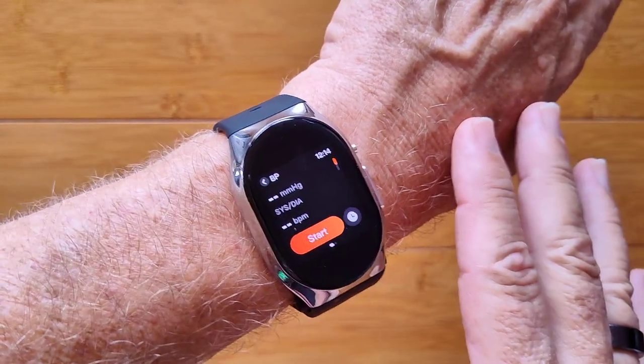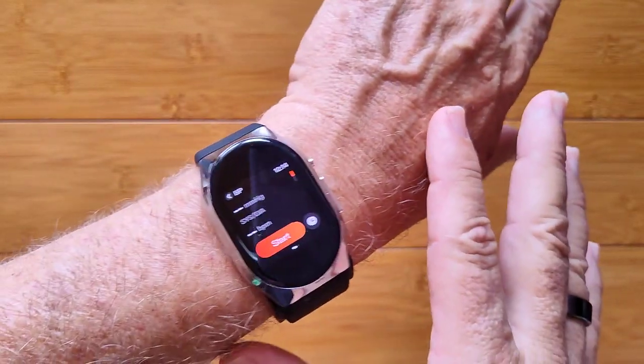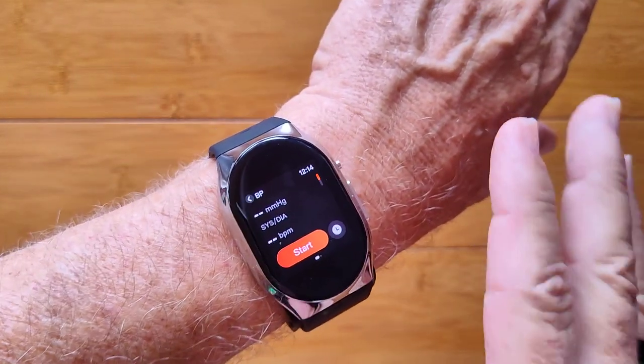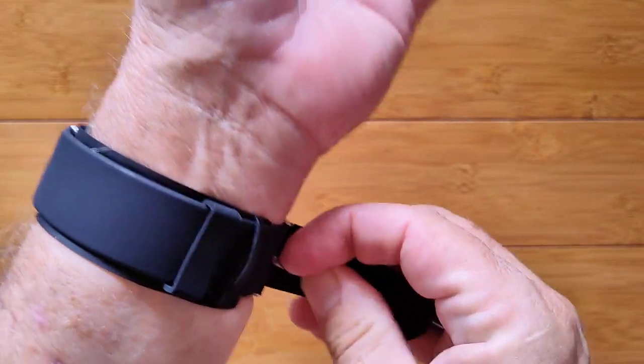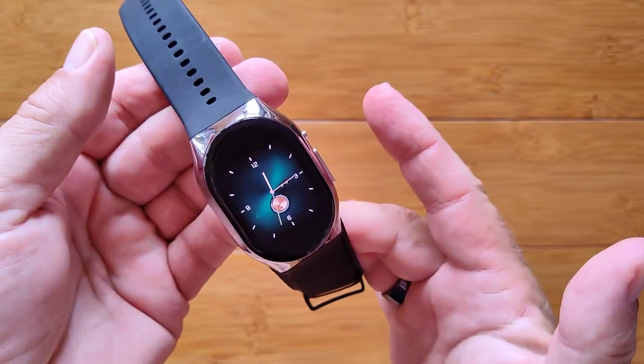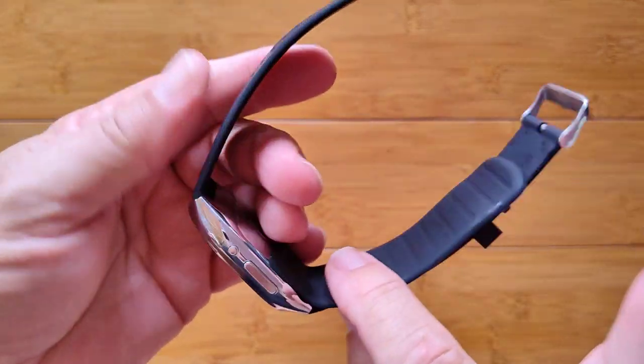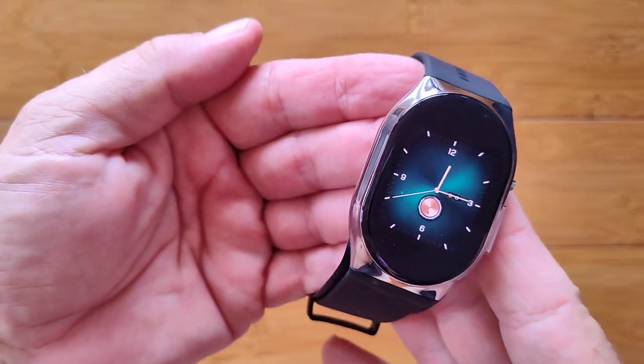It's got to be in just the right position or it will fail. When you have it set up, it's for reference only — not meant for medical diagnosis. It's something you can use to discuss with your doctor and compare readings with what they get in the office. It's called BP Doctor Pro and it's available right now. Check it out.